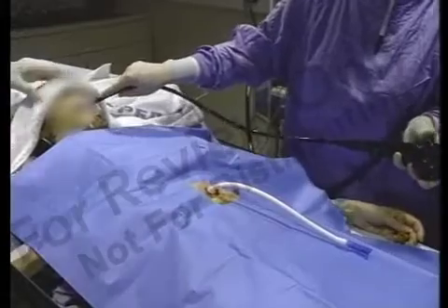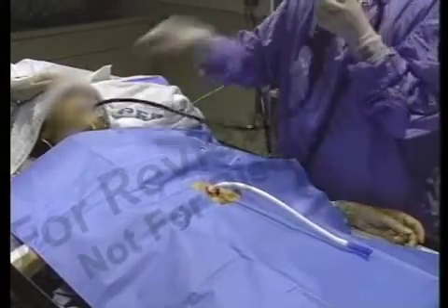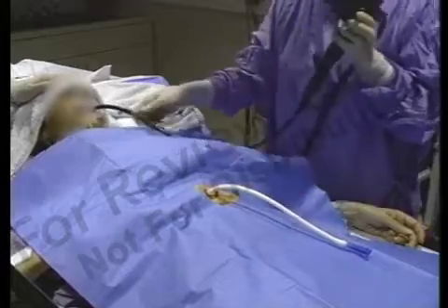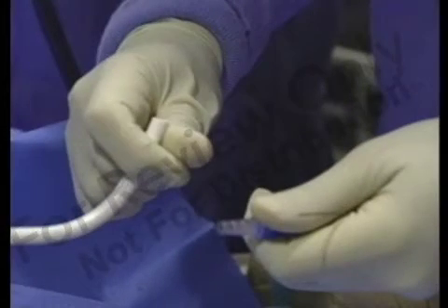After introducing the gastroscope, insufflate the stomach and examine the mucosa. The PEG 24 should be placed in the antrum toward the pylorus to ease insertion of the gastrojejunal feeding tube. Remove the feeding adapter and the bolster retainer or pull tie from the previously placed PEG 24 gastrostomy tube.